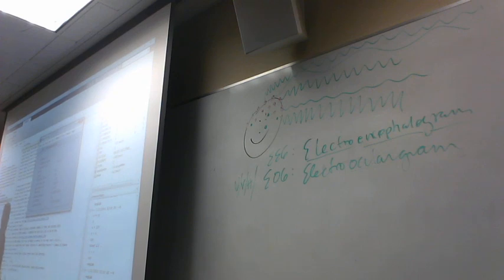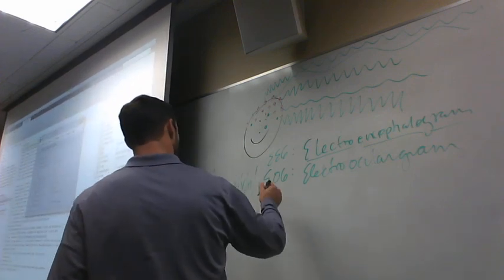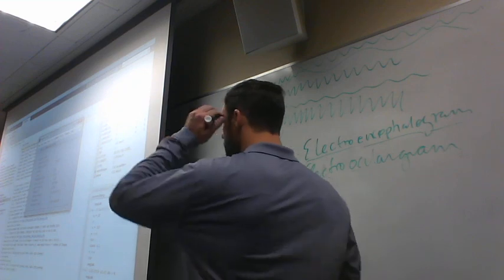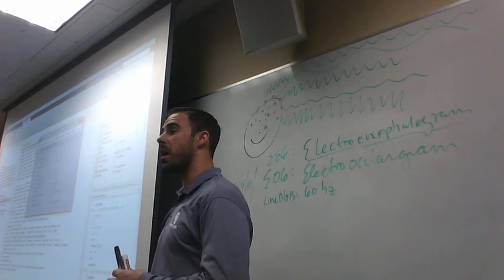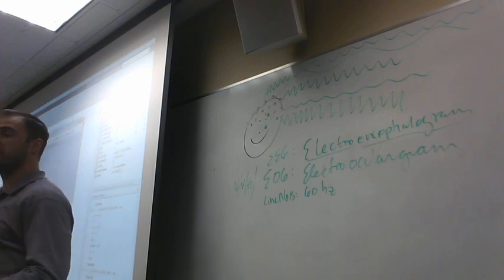But the idea is that there's noise. So we have EEG, EOG. We also have, let's say, line noise, 60 hertz from the lights. And what I was speaking of when we were having our conversation a moment ago was there's ways that you can actually account for that. If you're building a laboratory, you might want to make what's called a Faraday cage.